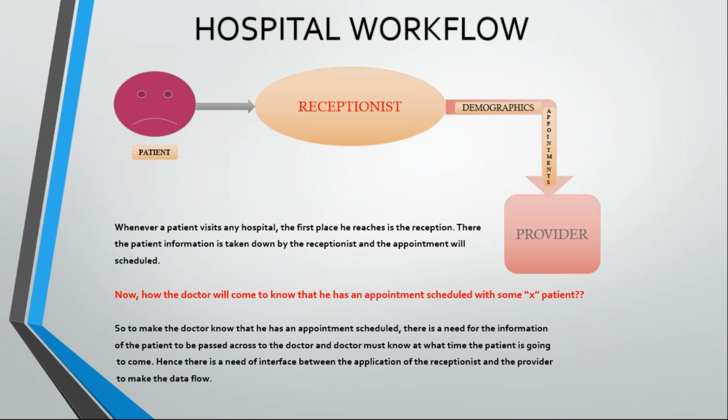So when we talk about HL7, we will always relate it back to hospital workflow, and then we will try to understand how these real-time scenarios that we have in hospital workflow reflect in terms of HL7 data.